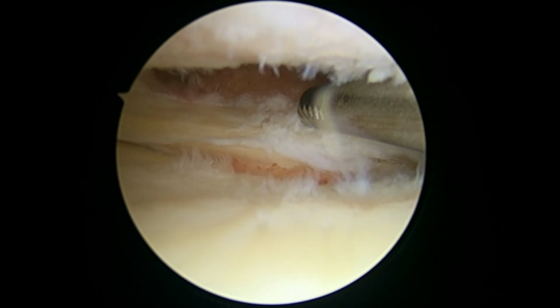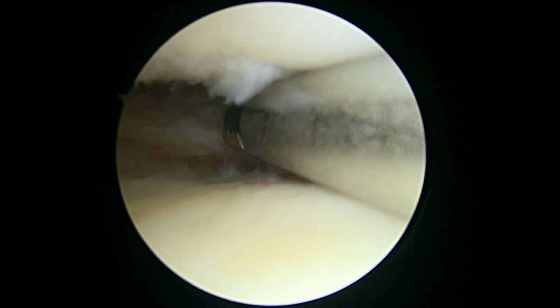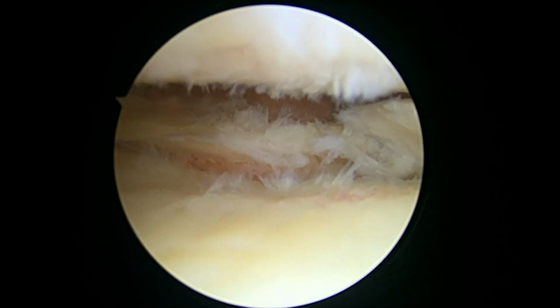Just making sure there's nothing loose way in the back here. So far, nothing. Okay, good. So far, the one loose piece has been in that medial compartment. We'll look in the patellofemoral compartment in a little bit.